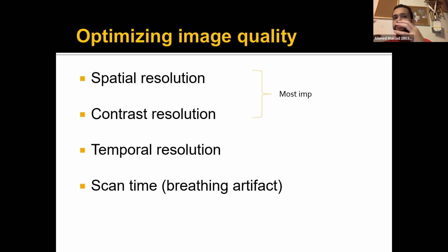So you want to minimize the scan time, so you minimize the breathing artifact. An artifact is a bad thing, all right? It distorts the image. You're welcome.